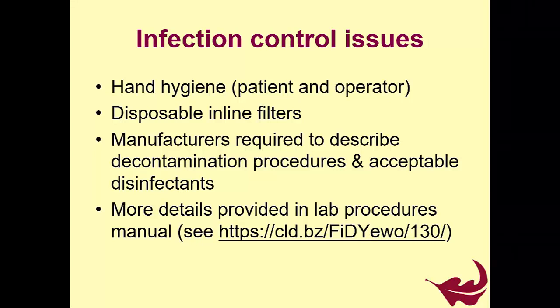And in the new guidelines, manufacturers are actually required to describe the decontamination procedures for the spirometry equipment and also list the acceptable disinfectants that one can use. So this is a new requirement that came out in 2019.